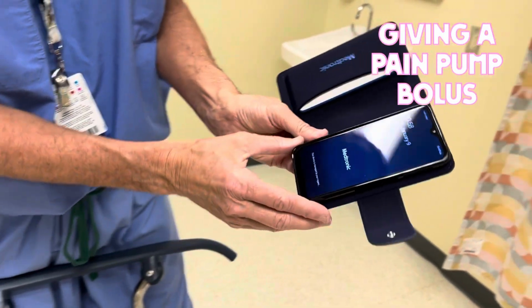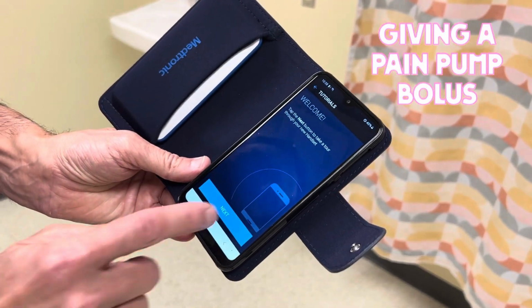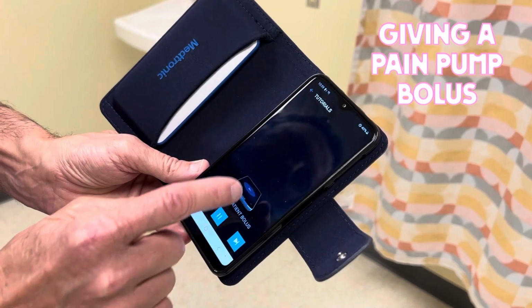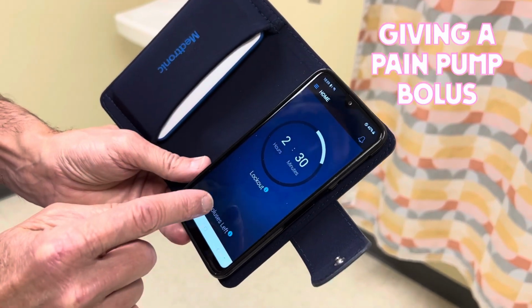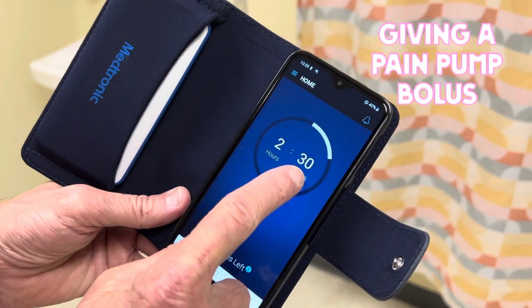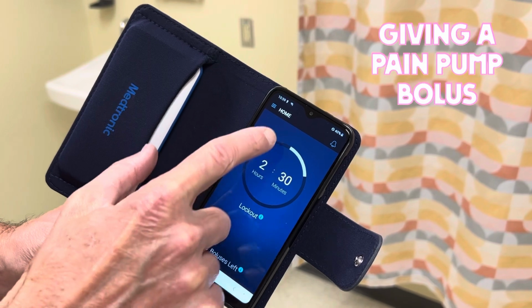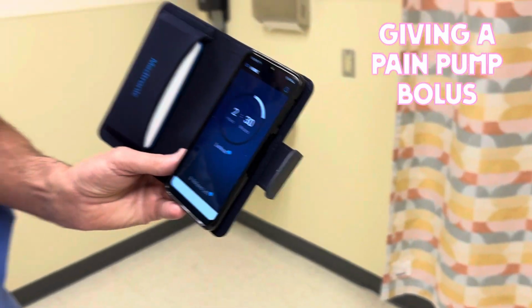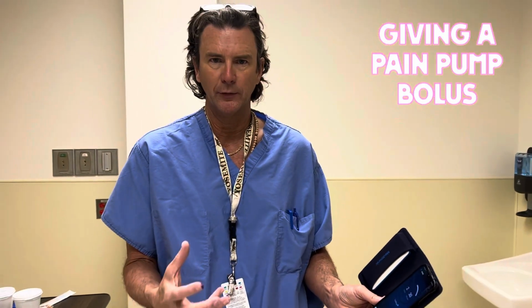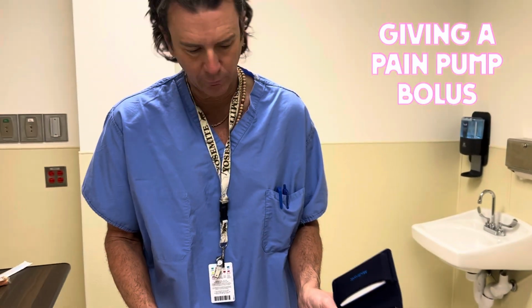You just push the button, it comes on and it says Medtronic. You swipe across the screen, and when you initially do it, you go through the little tutorials, but otherwise this is the screen that pops up. It gives you a running clock here. In this case it says 2 hours 30 minutes. When that runs down to 0, you're able to give an extra bolus dose. So this is the device that you use to do the bolus dose.